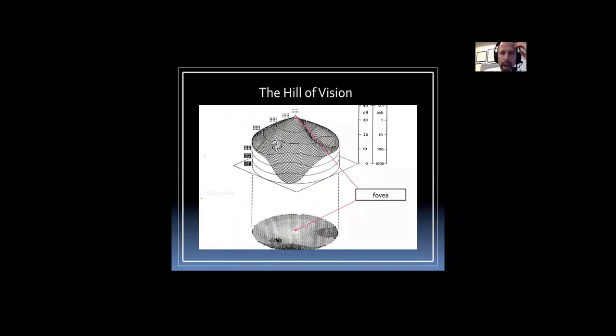When there are abnormalities in this hill of vision and decreased sensitivity on the grayscale, which is depicted below, we will see shaded areas. The shaded areas, of course, are relatively gray or black, just depending on how significant the decrease in sensitivity is.